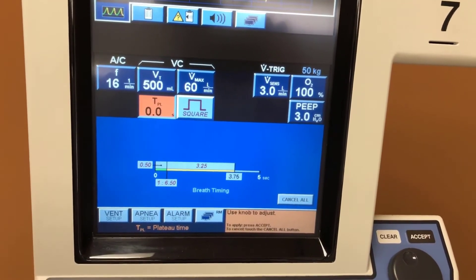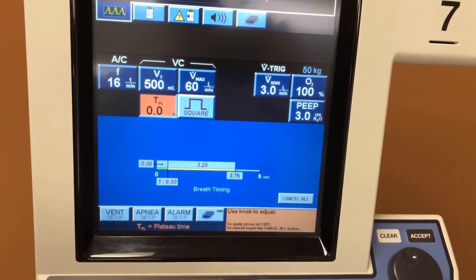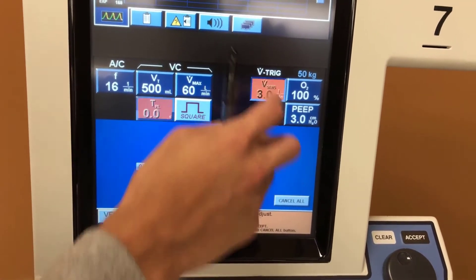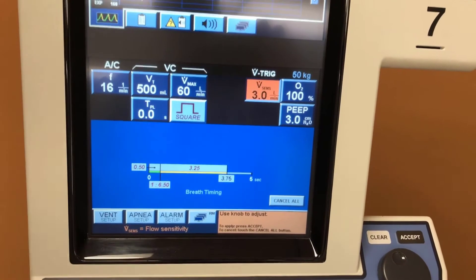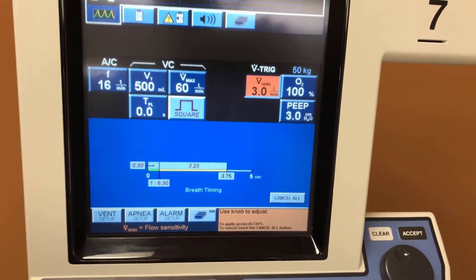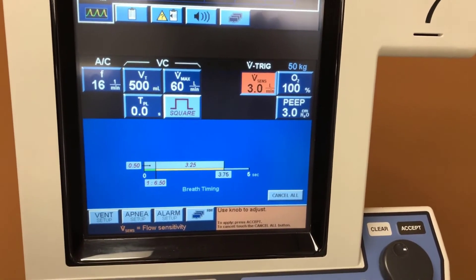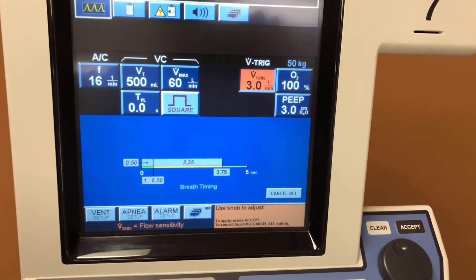Over here we have the plateau time. On this side we have the flow trigger.